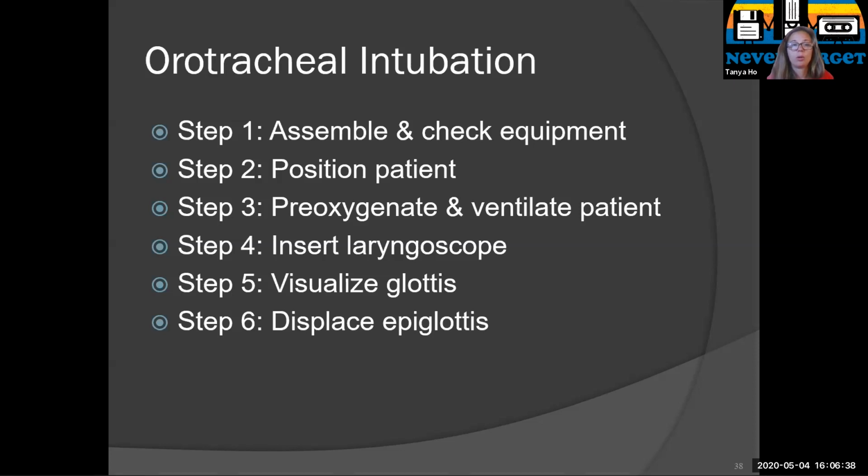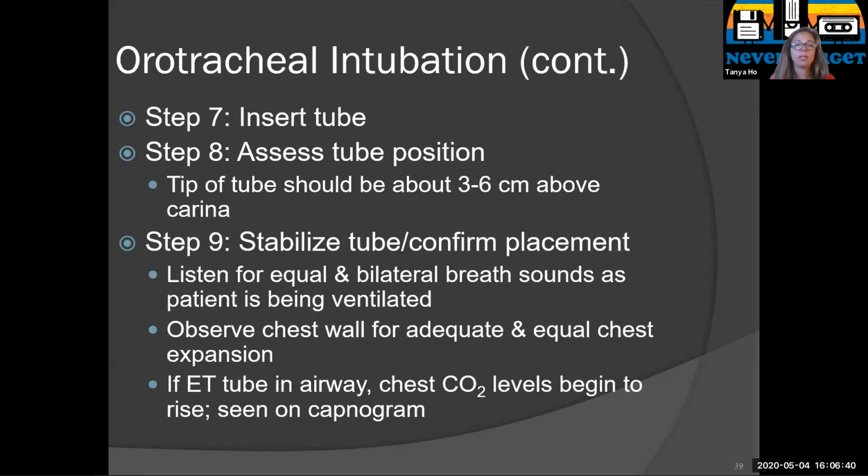So, inserting the tube. Then once you think the tube is in, you're going to pull out the stylet. You are going to put the capnometer, the end-tidal CO2 detector, on there, you're going to inflate the cuff, and then somebody's going to put the bag on the tube and give a breath, and the other person is going to be listening to make sure that it's there.